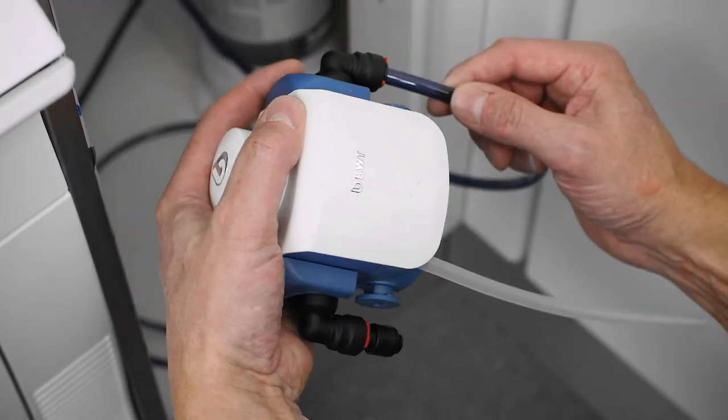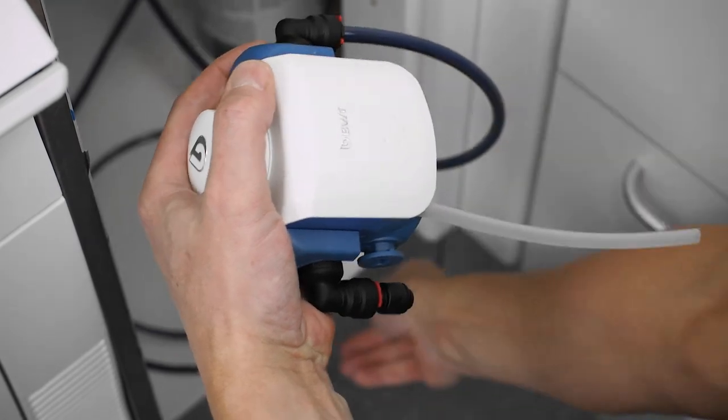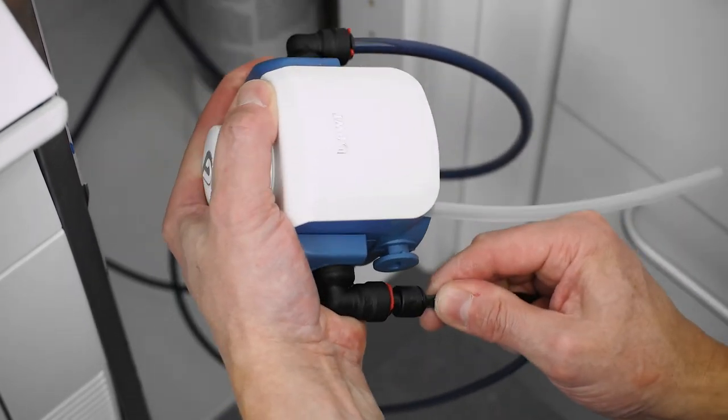Connect the other 8 mm hose from the pressure tank to the white filter head. Connect the 6 mm hose to the plastic reduction fitting. This will supply the clinic's autoclaves.